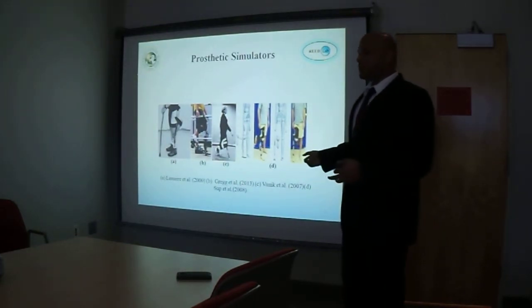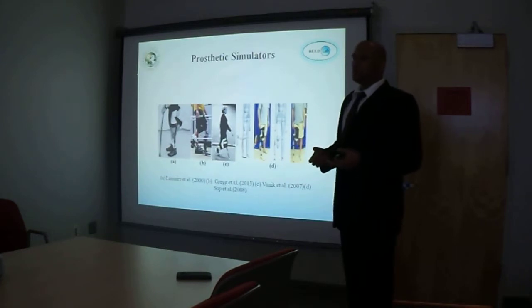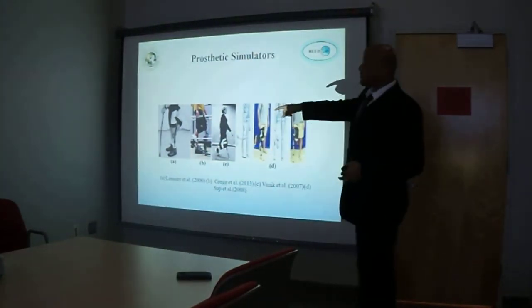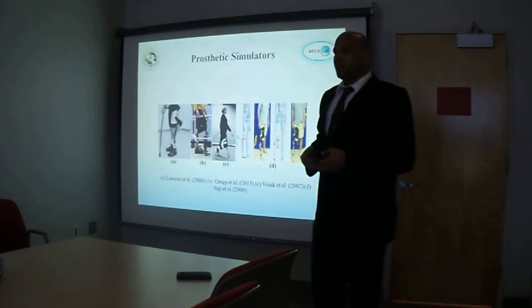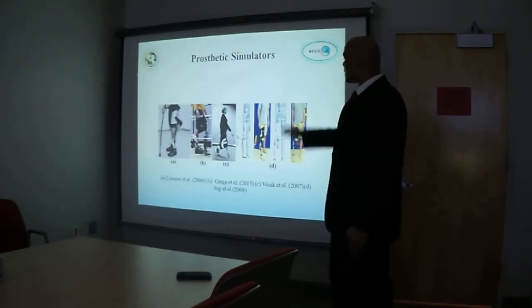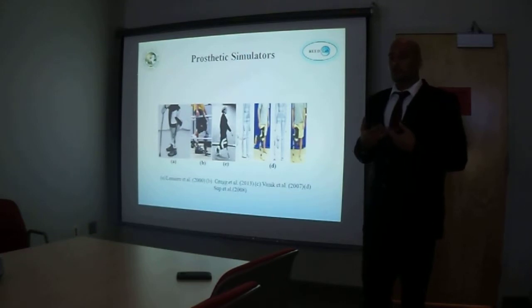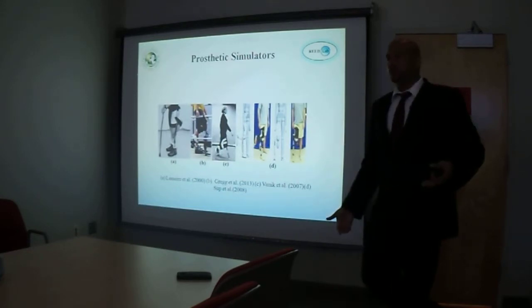And this is important because this might cause asymmetric torques and variances, which were not actually shown, but in my design, this is not happening. It will be in line. But the very interesting case is A, which is a transfemoral prosthetic simulator as well. They were studying the empathy that is created with walking on a prosthesis, and they wanted to show it to able-bodied people. For convenience's sake, they shifted the knee downwards, but they never studied anything about asymmetric knee locations, which is essentially what my research is focused on, because I'm studying the knee at different positions below its actual anatomical position.